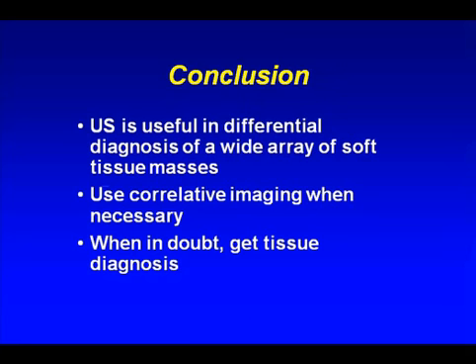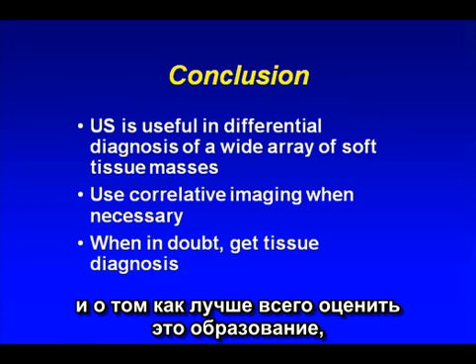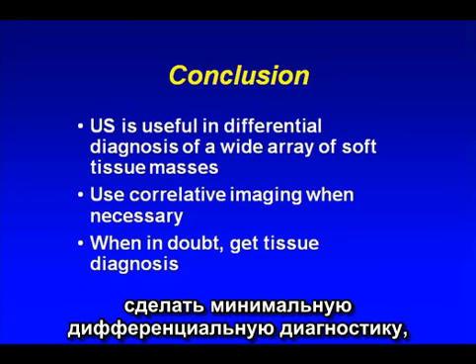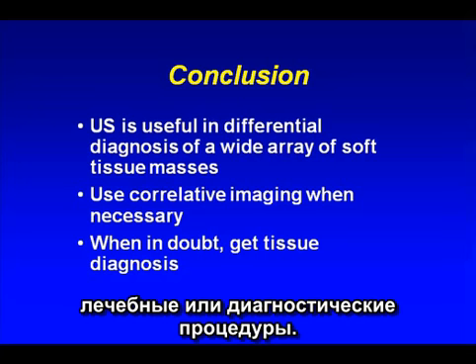Okay. So I hope that at least in this lecture I've given you a framework when you are presented with a patient with a palpable mass on how best to evaluate the mass, to at least narrow the differential, and to guide subsequent procedures, either diagnostic or therapeutic.